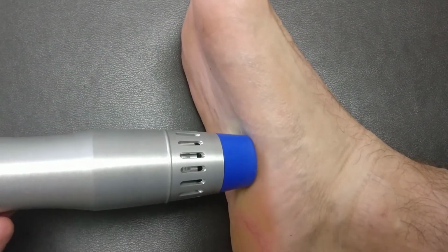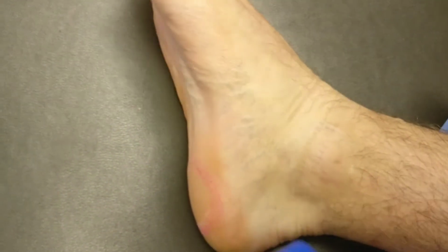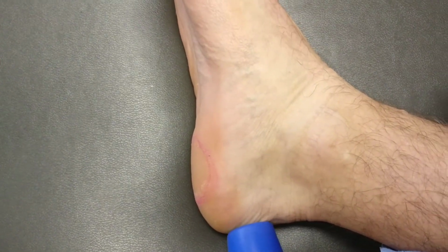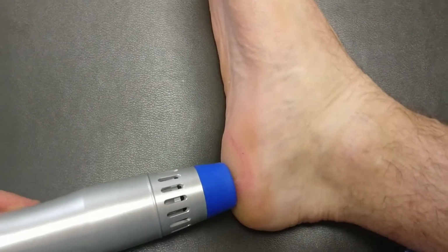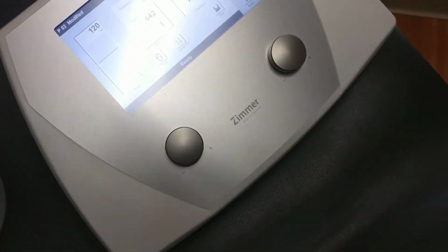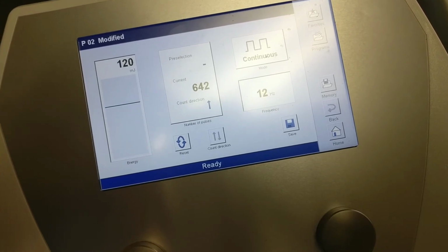So other areas you could use it on the inside of the ankle, the posterior tibial tendon. So right through there. And also the Achilles tendon. So right through there if you do have any Achilles tendonitis. And that actually feels pretty good doing it. You'd think that this thing being as strong as it is, it would cause some pain, but not significantly tender. There, you can put it back. And you see right there, we did about 642. You'd probably do about 2,000 the first time through.